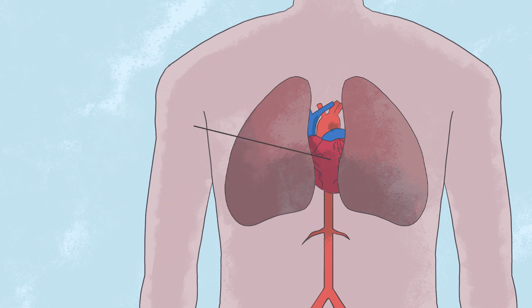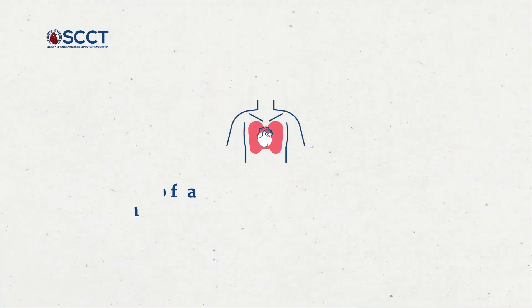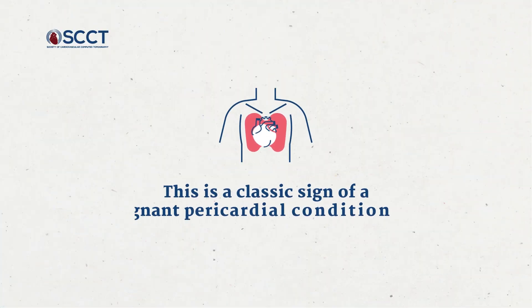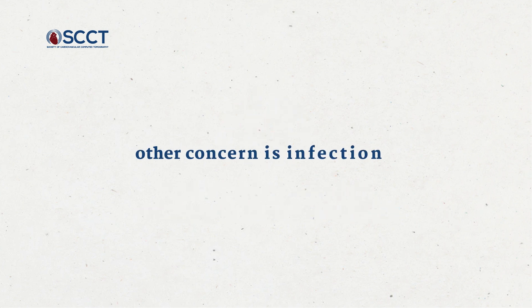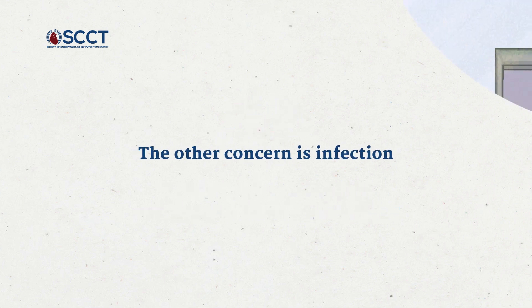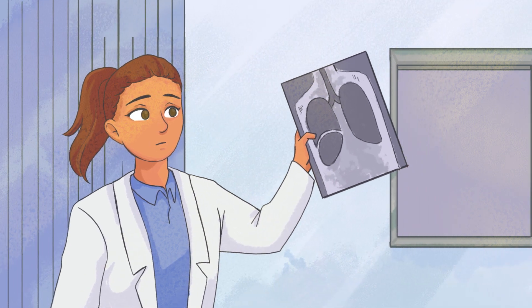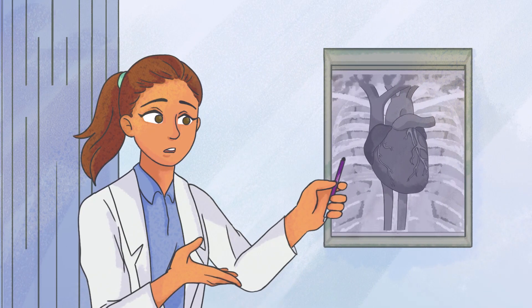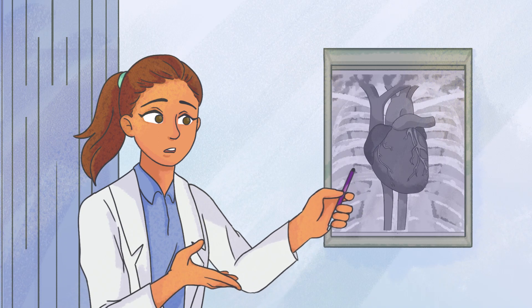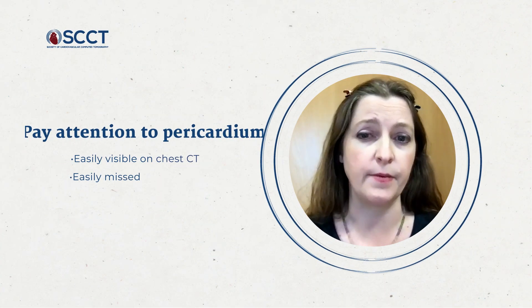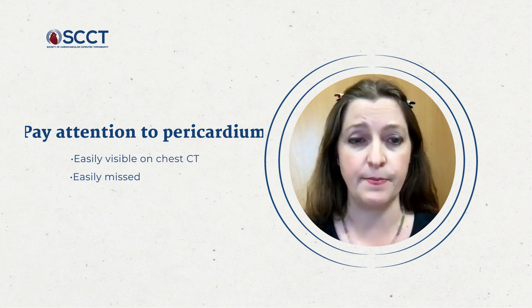Here you can see the pericardium is thickened and irregular. This is a classic sign of a malignant pericardial condition. The other concern is infection. Here is a patient with a large subdiaphragmatic abscess, and two days later they developed this small infective pericardial collection. So pay attention to the pericardium — it's easily visible on chest CT and easily missed.